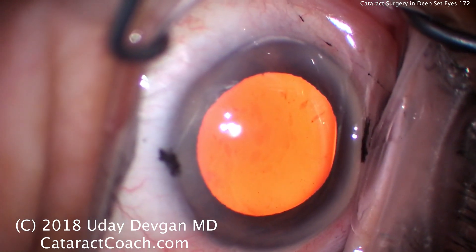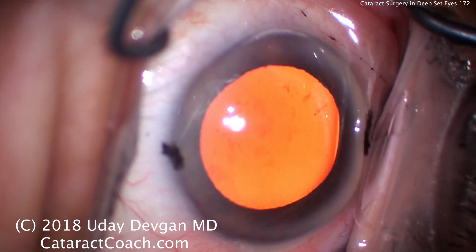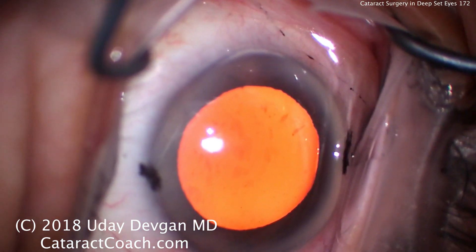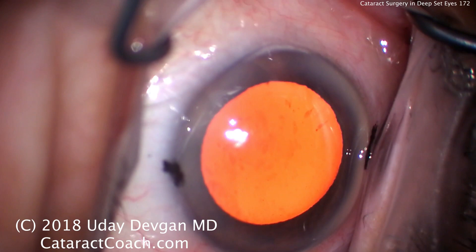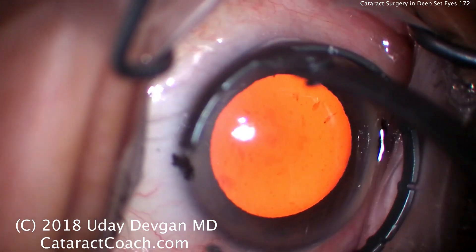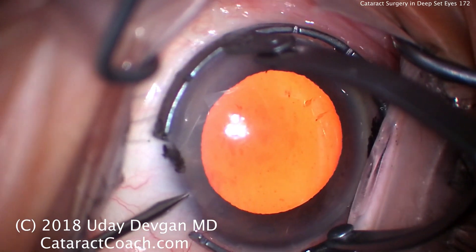It's cataractcoach.com and we have an unusual situation here. We have a really deep-set eye — an elderly patient with loss of some orbital fat, a prominent brow, and the eye is very, very deep-set. You can see it looks like we're operating just down a hole almost. Very narrow palpebral fissures, and it's even difficult to put the fixation ring on the eye.